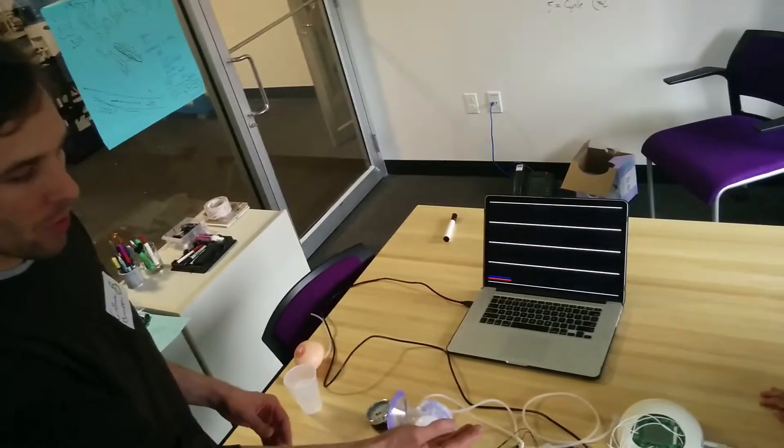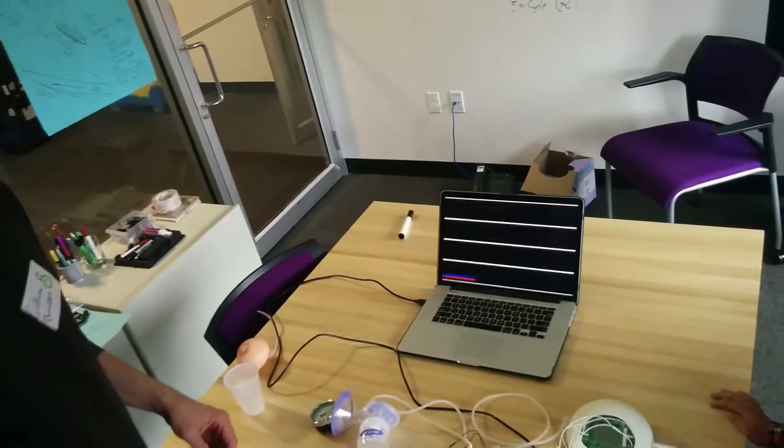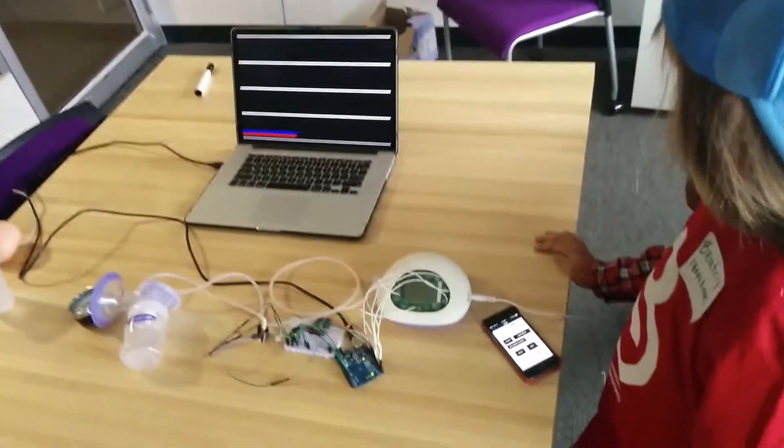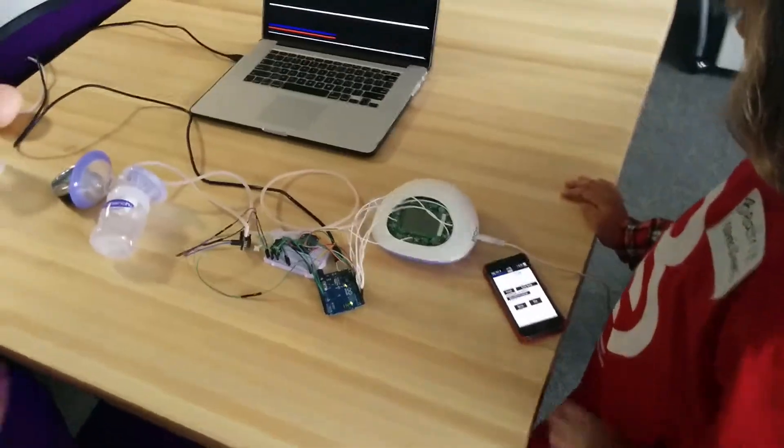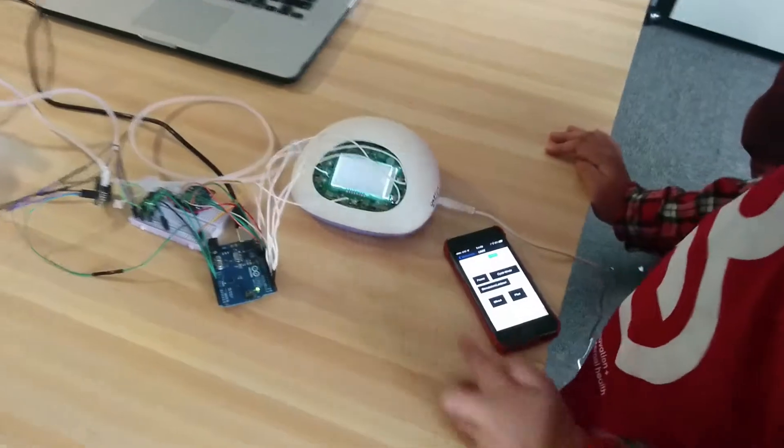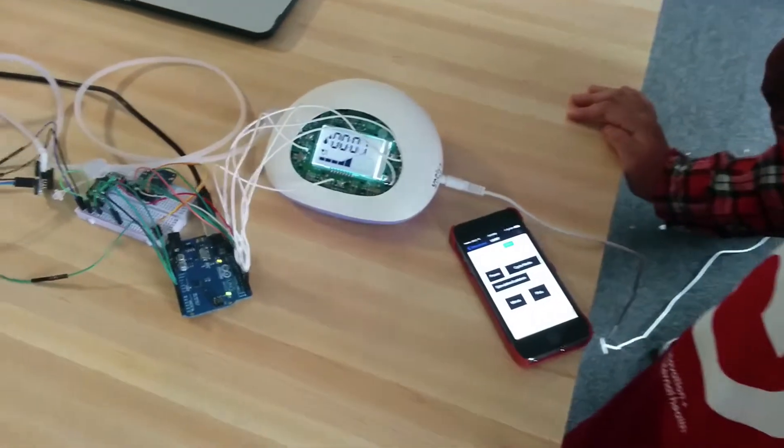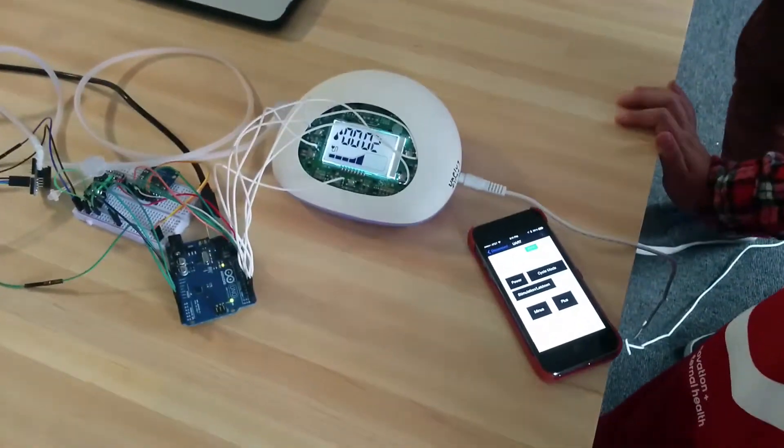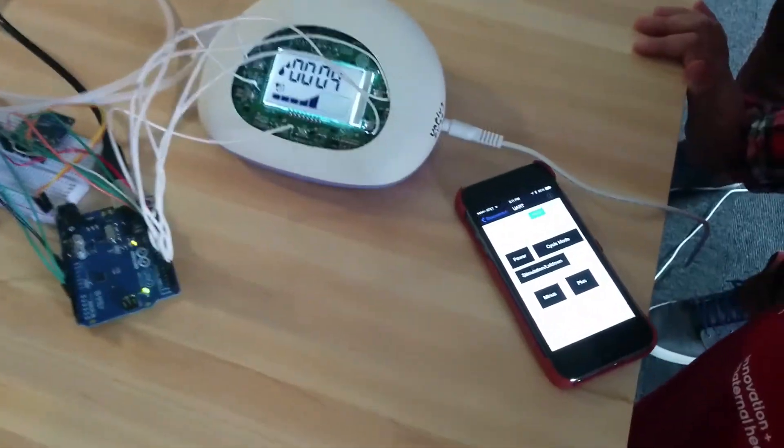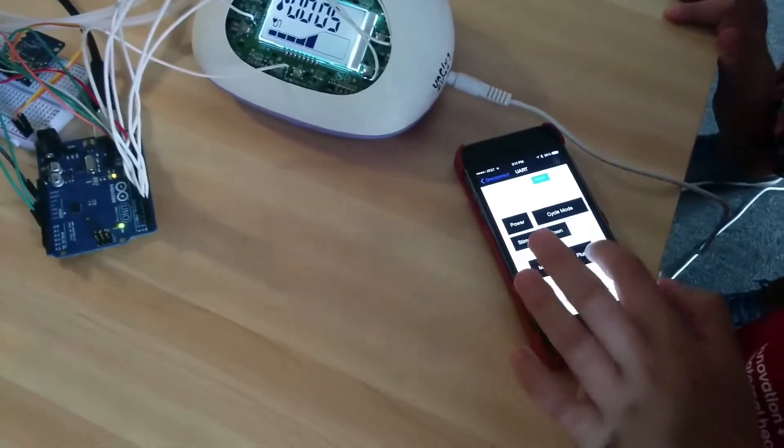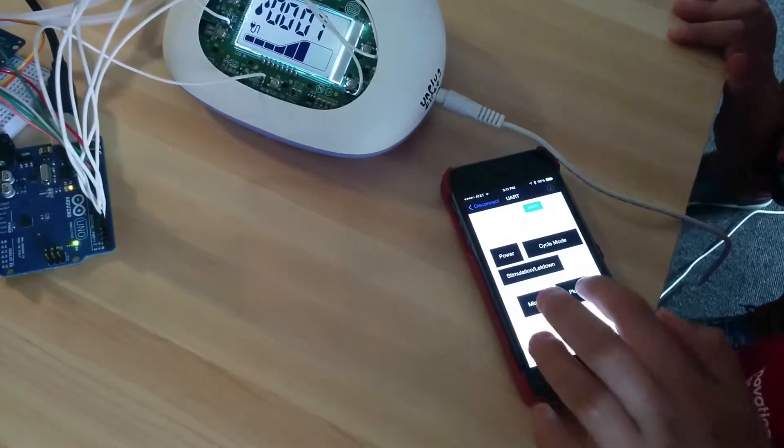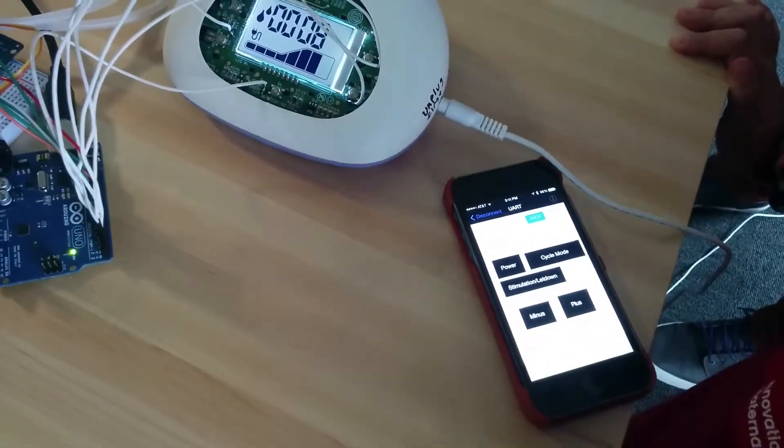The first thing we're going to show you is how we can turn the pump on remotely with the smartphone. First we power on the pump, and then we can adjust the speed and power settings.